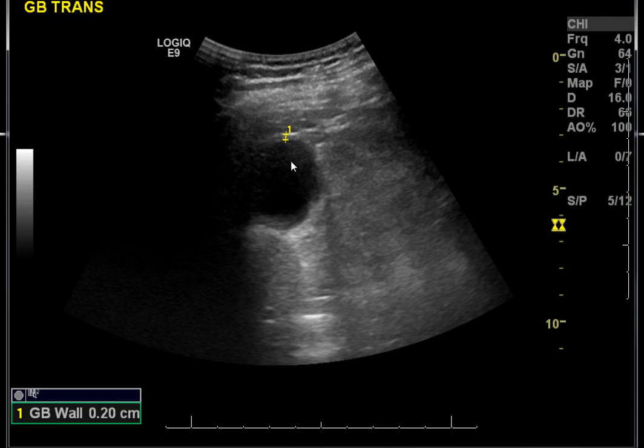This is another friendly artifact that I want to display for you. You can see that this is the gallbladder here, so no sound was attenuated at this level because this is a fluid compartment without many interfaces. But beyond the gallbladder, you see nice acoustic enhancement. That tells you this is a poor attenuator. So fluid-containing areas are very smooth, soft tissue masses can transmit sound without attenuation, so you get acoustic enhancement.